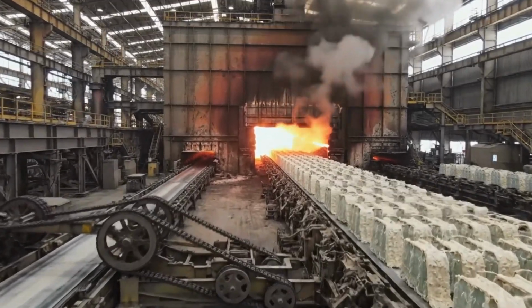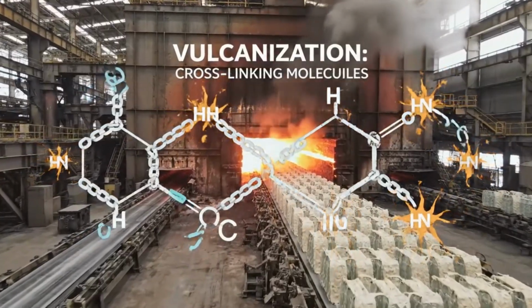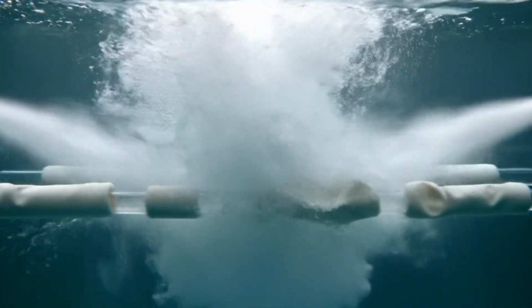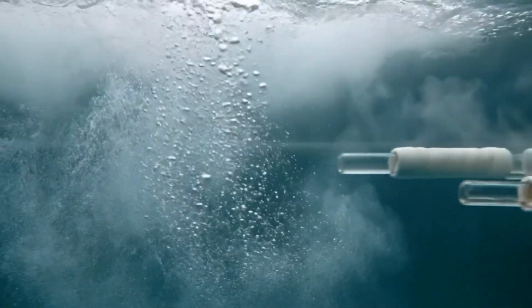Vulcanization is the heart of the process. Heat triggers a chemical reaction that cross-links the molecules, giving the condom its famous stretch. Bleaching is a critical health step. It removes natural latex proteins that can cause allergies, making the product hypoallergenic.